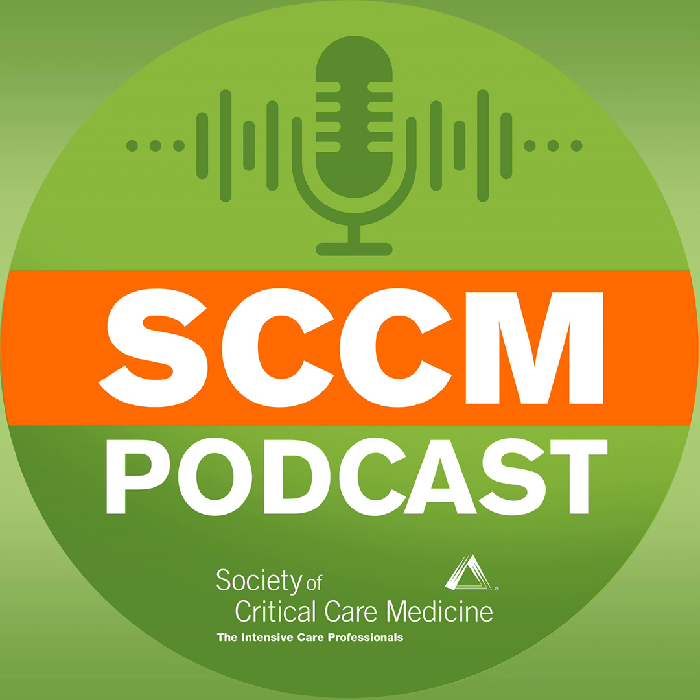Okay, very good. Now tell us about your experience with processed EEG. My experience with processed EEG is in both the OR and the ICU. In the OR, the way that I usually use it is I'll put it on an awake patient, and I'll explain to them why I'm putting the sticker on their head, because that's usually where it goes. I'll say, it's going to help me figure out how asleep you are. And I can actually watch the processed EEG numbers change as that patient becomes sedated, as I administer medications.